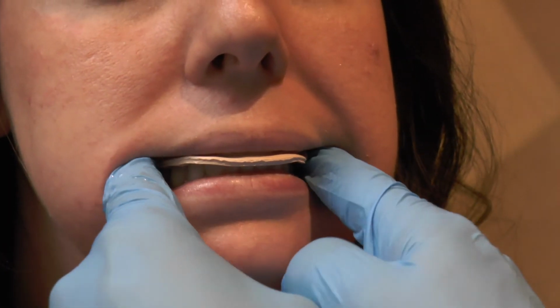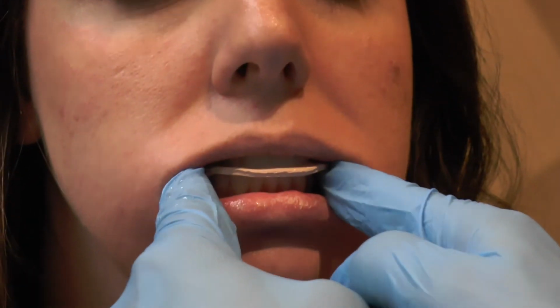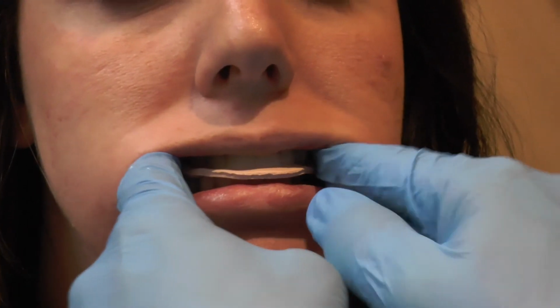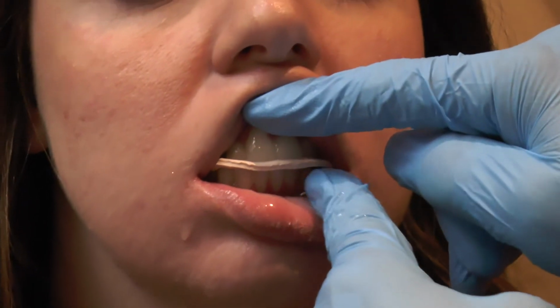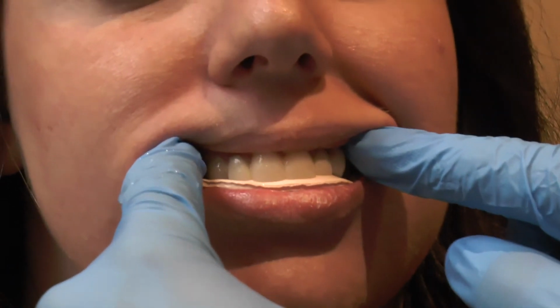As they bite down, I want you to have the patient take their tongue and push up against the material on the inside, upper arch, and then with your fingers, I just need you to passively and gently mold it up against the teeth. And then just leave it in place until it gets a little bit firm, and then remove it and run it under some cold water.